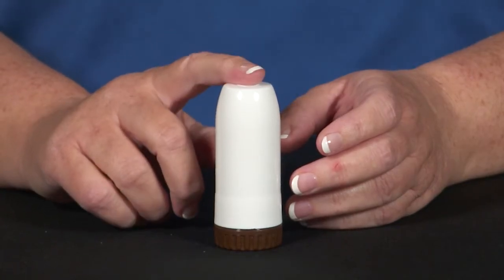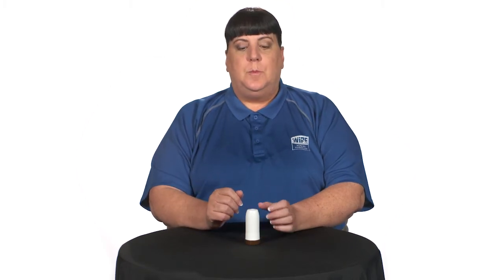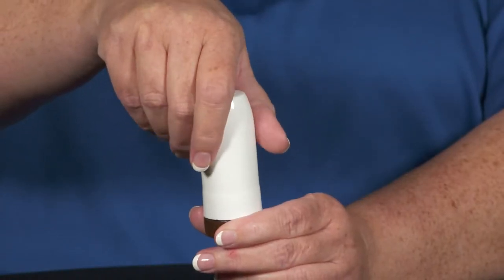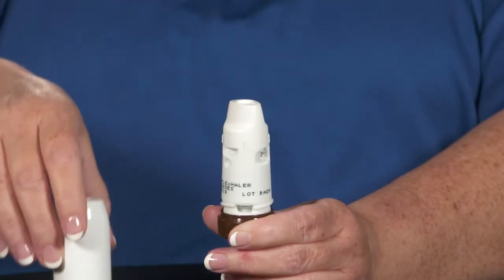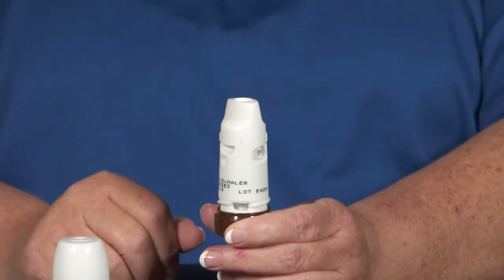The Flexhaler is a dry powder inhaler, or DPI, that contains multiple doses of medication within this case. Before using the Flexhaler for the first time, you must prime the inhaler once. To prime it, hold the bottom of the device. Remove the cap covering the mouthpiece by twisting it counterclockwise and lifting the cap up and set it aside.